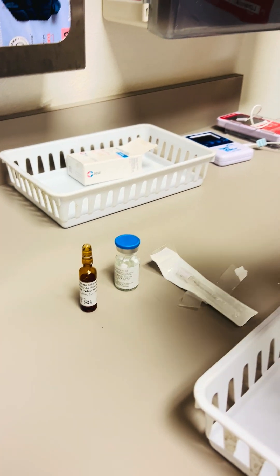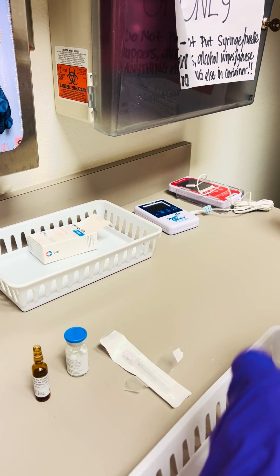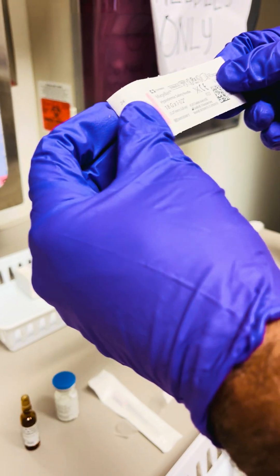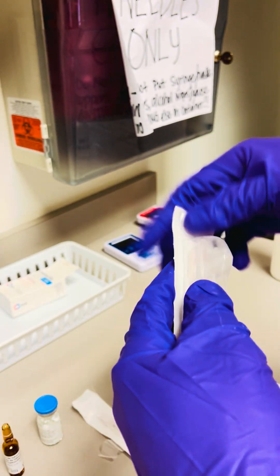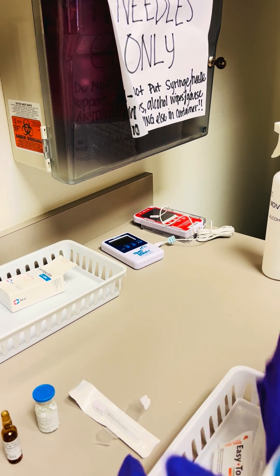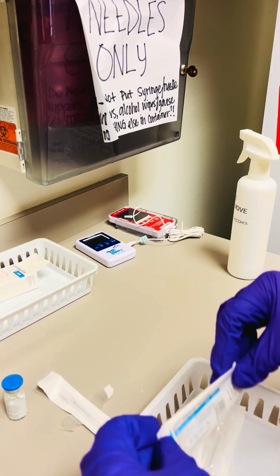You'll also need a 5 ml syringe, an 18 gauge needle to draw and prepare the vial, and then a 23 gauge needle for the final administration of the dose.